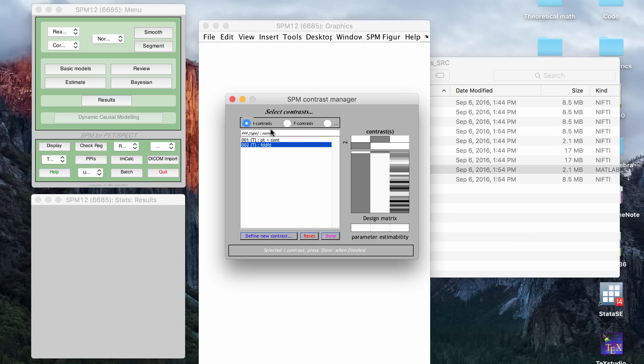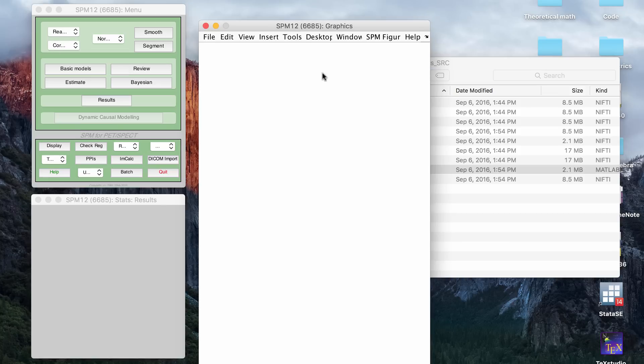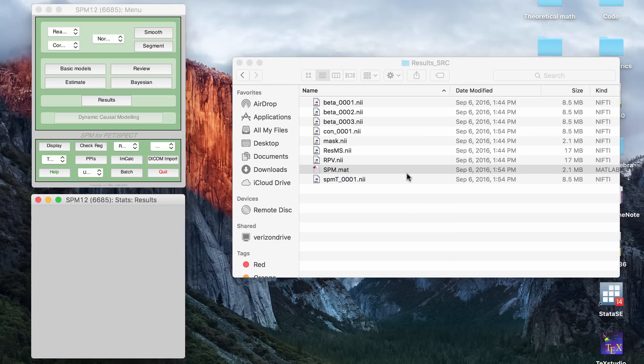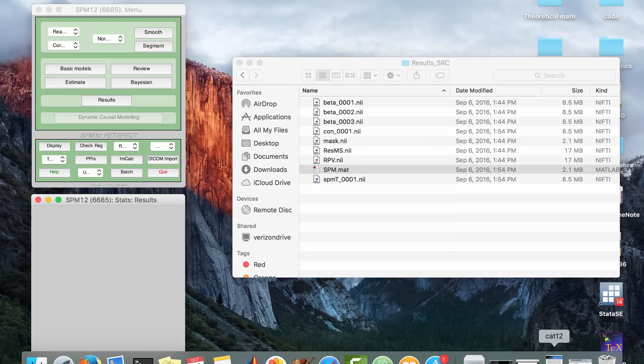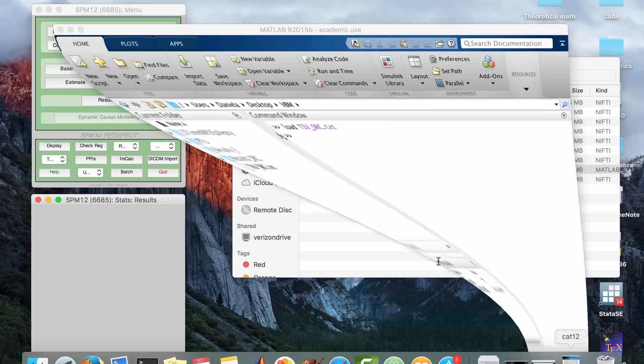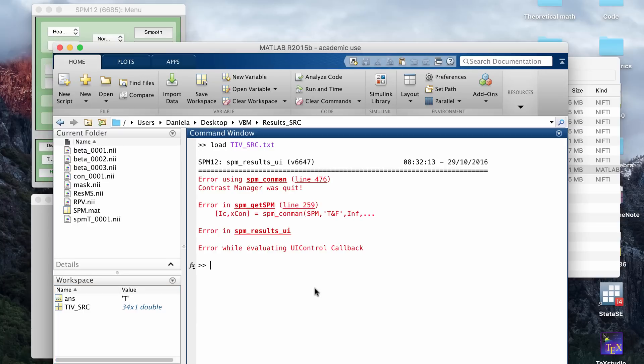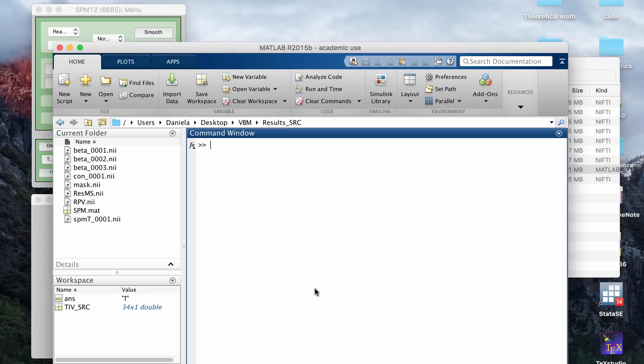Then you click done. That will run really quickly. And then that will show the results on a window here. Again, for me, I don't look at the results through the SPM GUI. I use a program called XJView. And so you'll be ready to use that once you're finished with the results button.